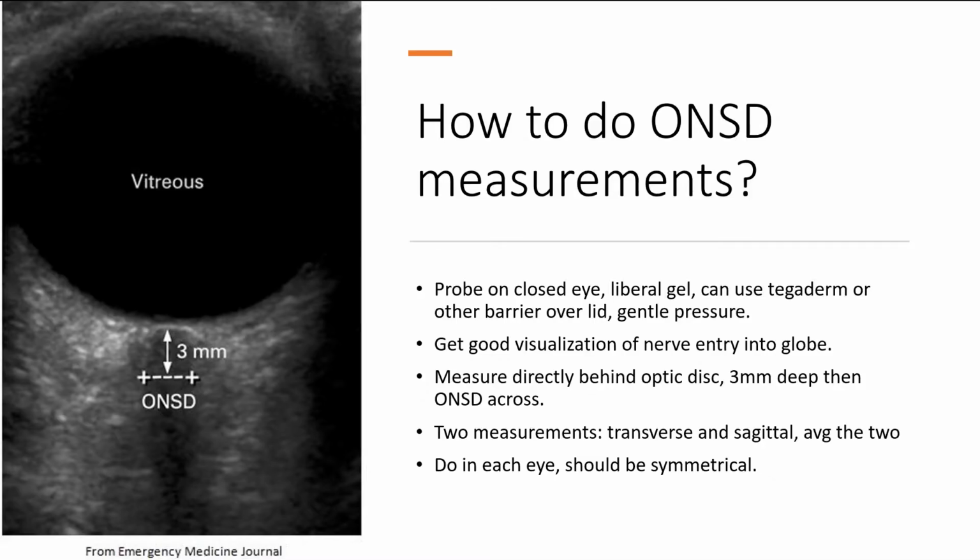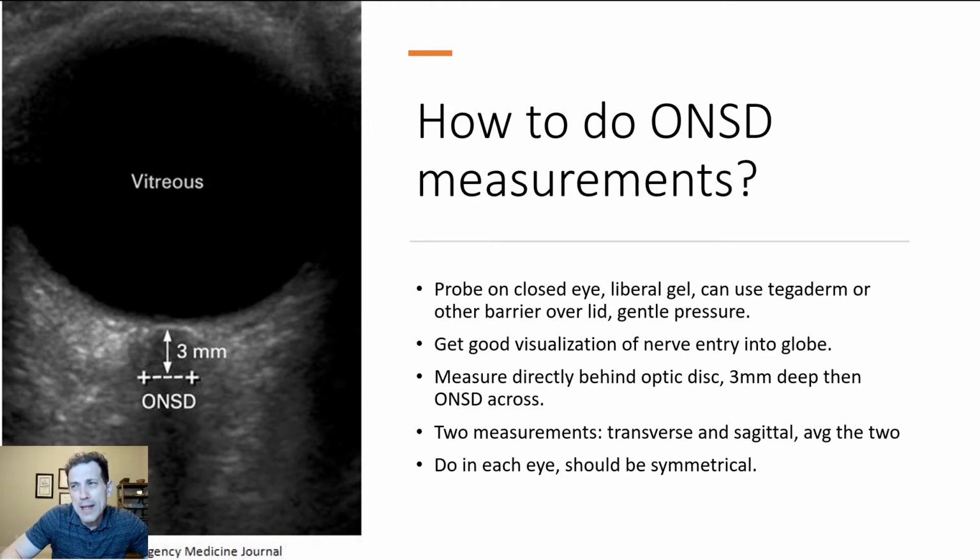Next, we want to take our measurements at a 3 millimeter depth. And we're going to painstakingly review some of the research in reference to that 3 millimeter depth and why we take it there, as compared to 5 millimeters or deeper.